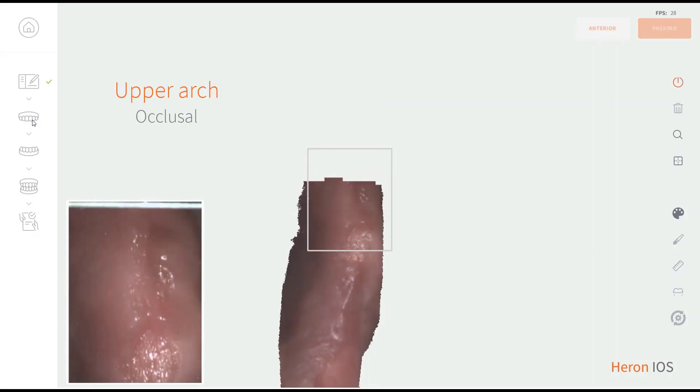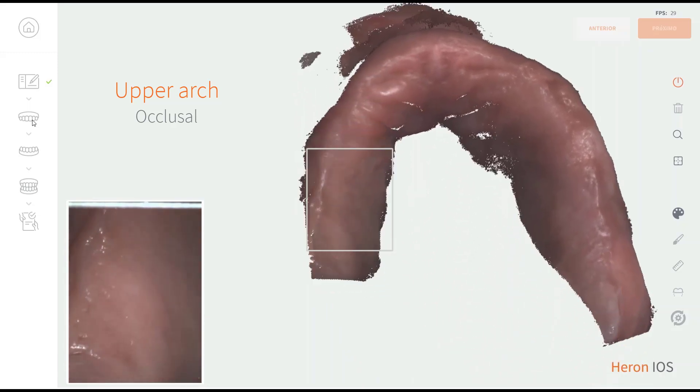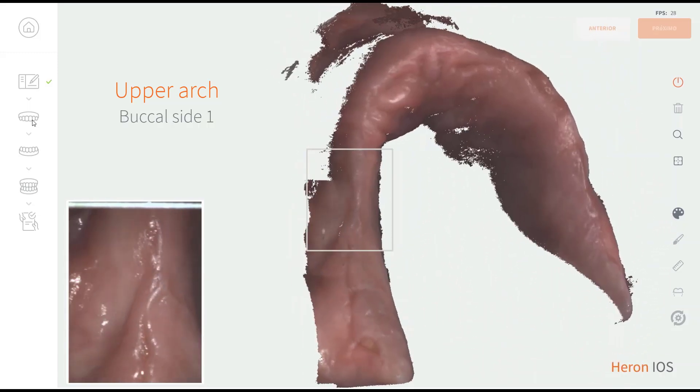Scanning fully edentulous patients can be very easy with your Heron. Just follow the standard scanning strategies and pay attention to the extra tips.